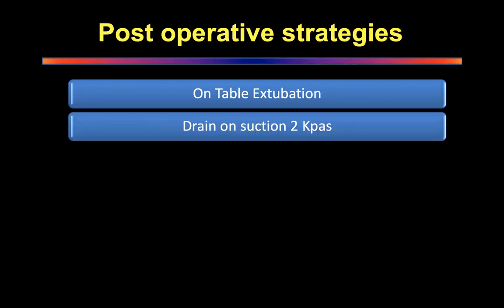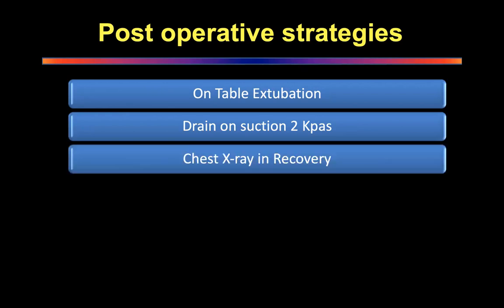I always connect my drains to suction. There are 2 philosophies, one on suction and one no suction. I'll talk about that in 1 minute. But personally, I've always worked with suction, and I'm quite happy with that.